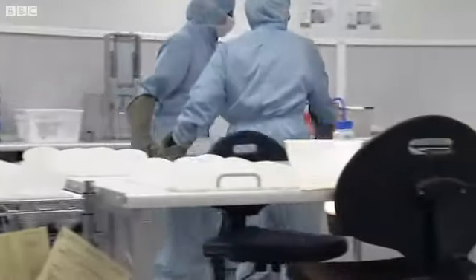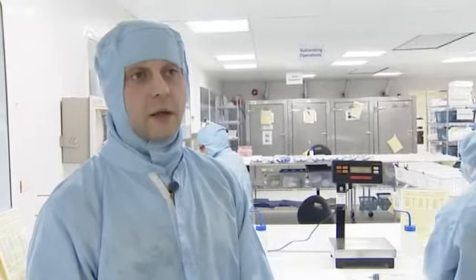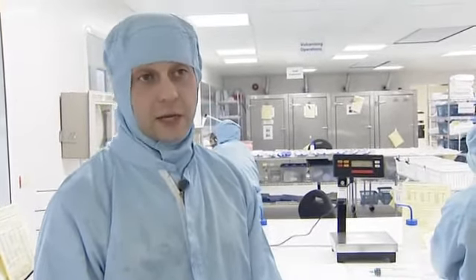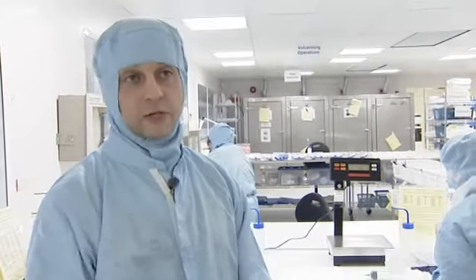Goes through into our dispatch department, boxed and sent to our outsourced sterilisation company. It would then return to us, and then we would do final packaging, put the product branding name on it with instructions for use, available to sale for the customer.